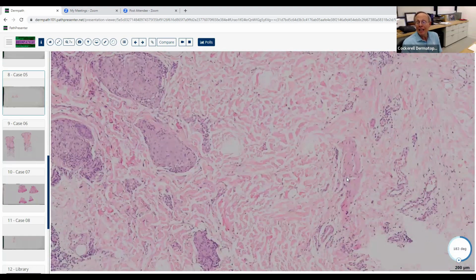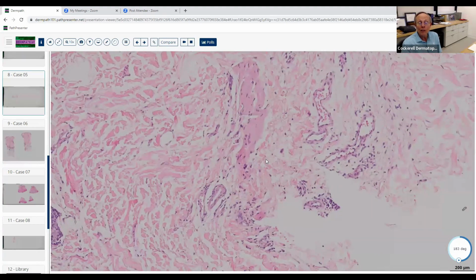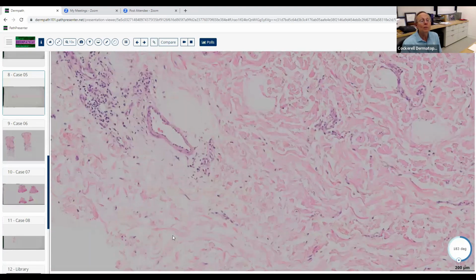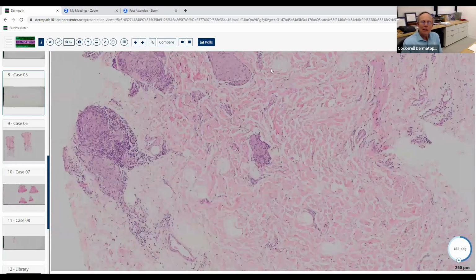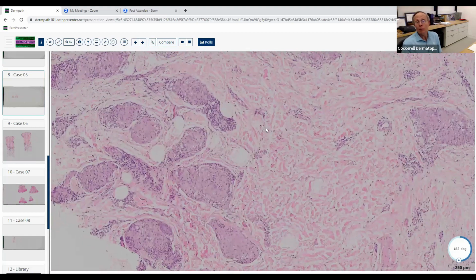And if you see an intact nerve, now this may be a smooth muscle bundle. In tuberculoid Hansen's, this may be possibly part of a nerve. There are some blood vessels here. There may be a little nerve twig in here. If you see an intact nerve in tuberculoid Hansen's, it ain't Hansen's, because it pretty much wipes out every single nerve twig. So it would be in the differential though.